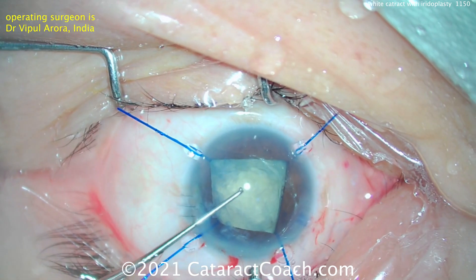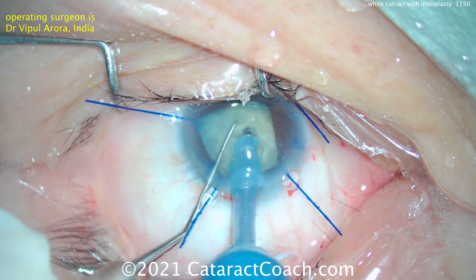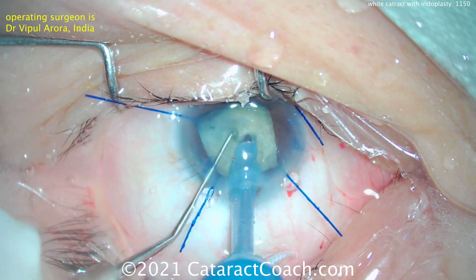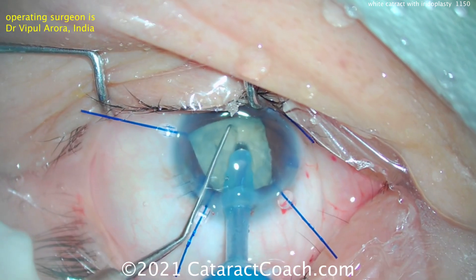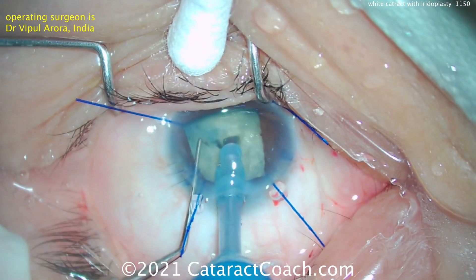A little more viscoelastic, and now time for some phaco. Here's the phaco probe going inside the eye, and a nice chop — beautiful chop there. And then rotating it around and getting these pieces out.